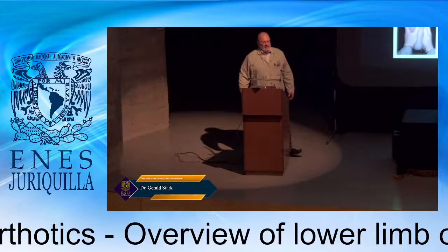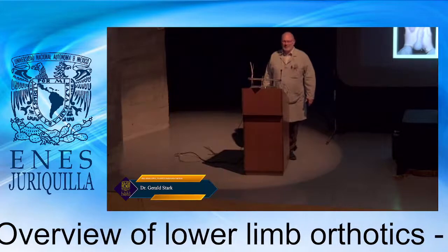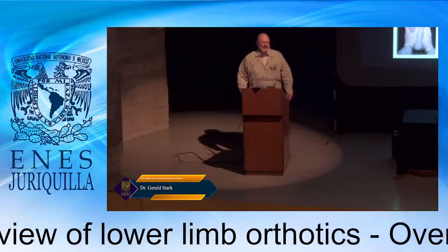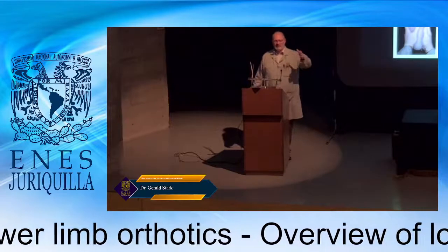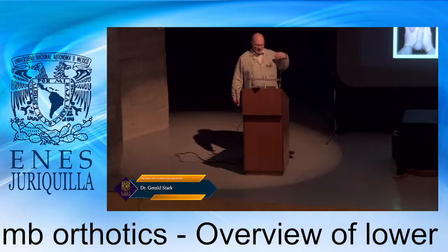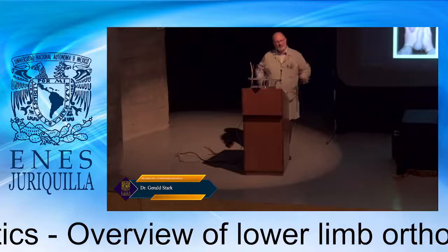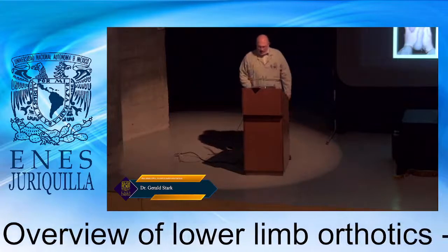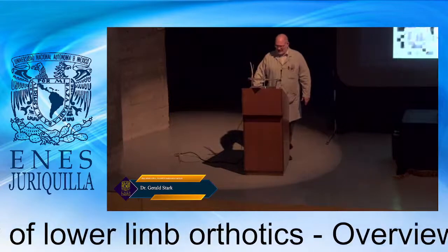In many ways, people think that transtibial is easier than transfemoral. And maybe that's because transtibial socket designs are more apparent. The skeletal structures are more available than transfemoral, where it's more soft tissue and muscularity. But there's always equal opportunity to make things bad.